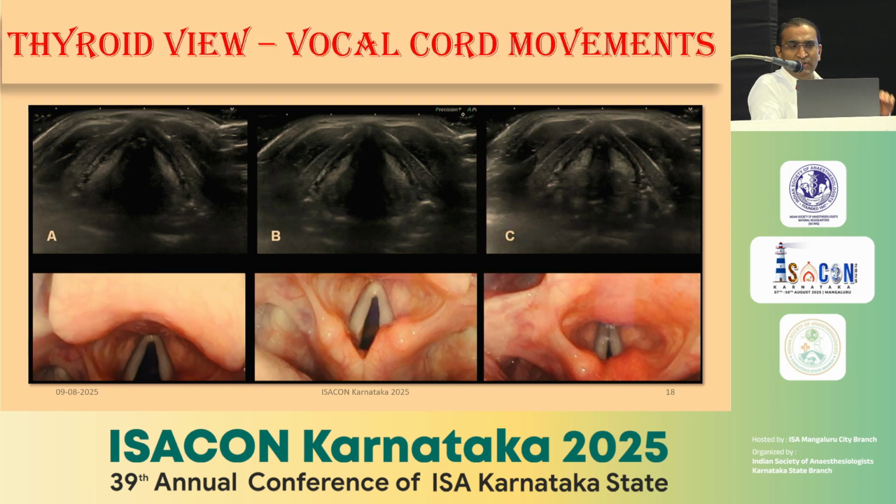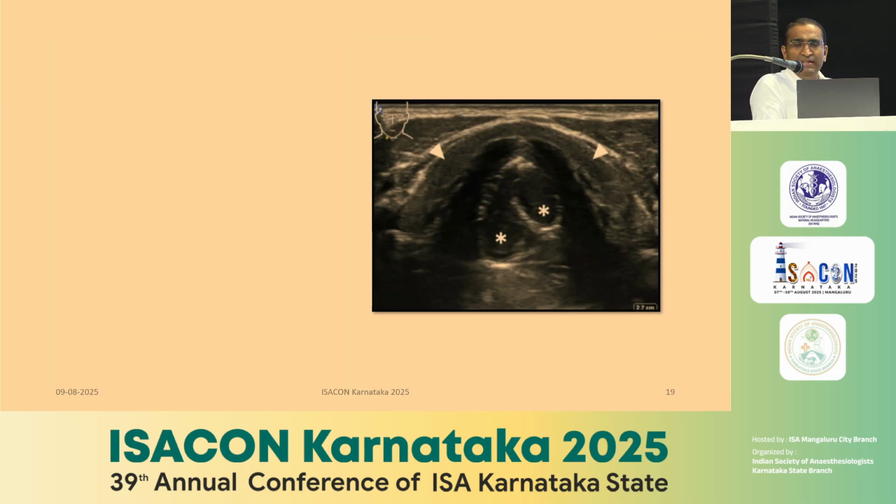When we compare this with the endoscopic view, whatever image we took in the ultrasound exactly corresponds to the endoscopic images of the vocal cord. This is a very interesting case.